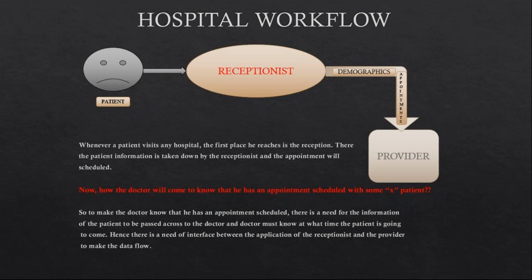We'll quickly go through a slight introduction on what happens in the hospital and how they deal with the data within the hospital. Over the course, we'll be referring back many times to this blueprint, or this hospital workflow, to understand the live scenarios better on how HL7 messages are interpreted.